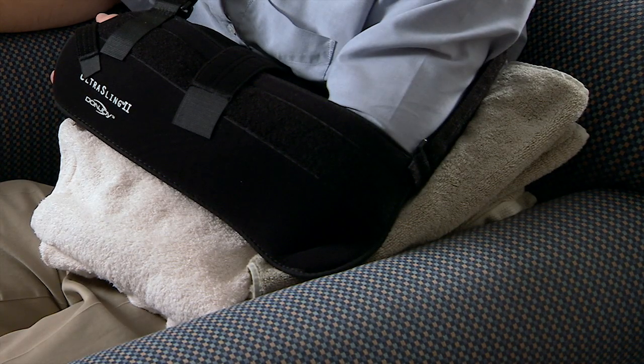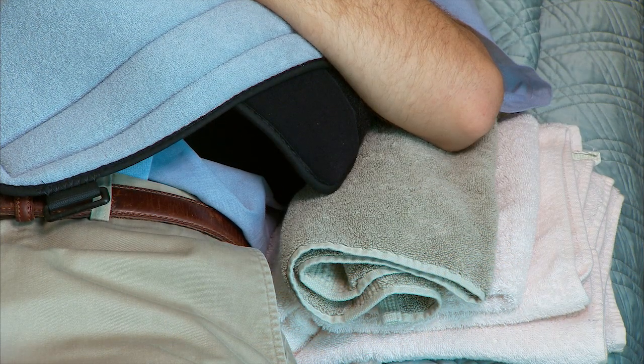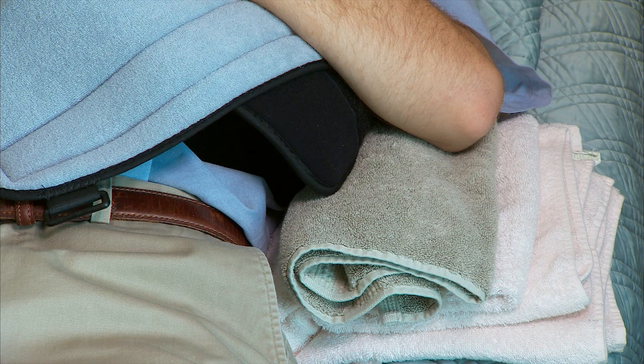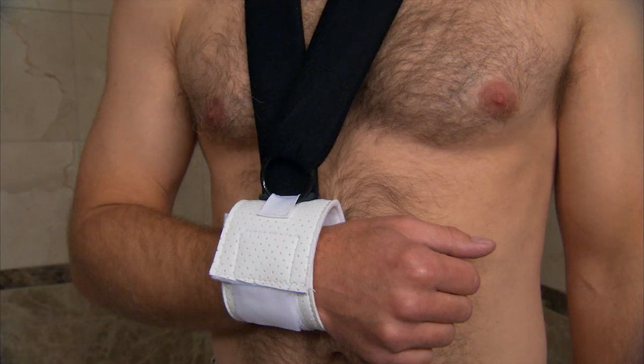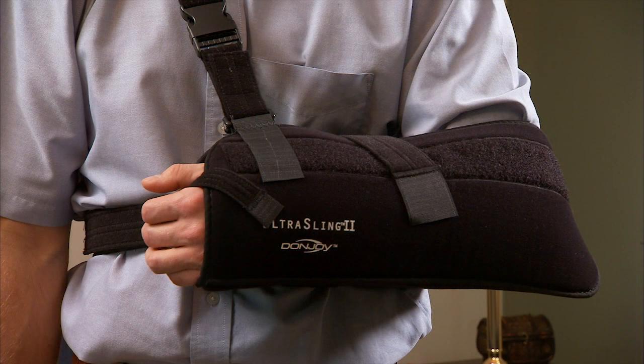When you sit, put folded towels behind your elbow to keep it forward. When you lie down, use folded towels to keep your elbow forward. Your physical therapist may give you instructions for using a simpler type of sling when showering. Ask your health care provider any questions you have about how to safely put on and remove your shoulder abduction sling.